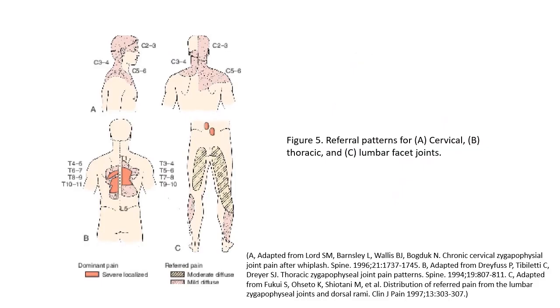Physicians are recommended to incorporate facet loading maneuvers into physical examination to assess pain distribution and referral patterns, shown in figure 195.5. For diagnostic blocks, most clinicians will give the patient 2 sets of unsedated medial branch injections under fluoroscopic guidance. The patient is blinded to whether a short or long-acting local anesthetic was injected. Post-procedure, the patient is asked to complete a pain diary every hour. If the pain relief for each of the 2 blocks is concordant with the expected duration of the local anesthetic, the clinician can decide to proceed toward denervation.